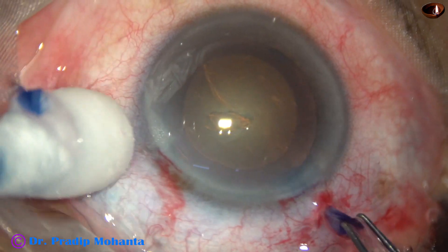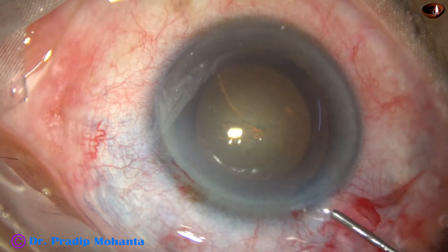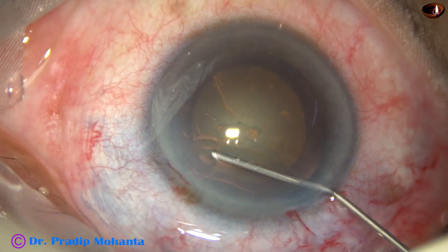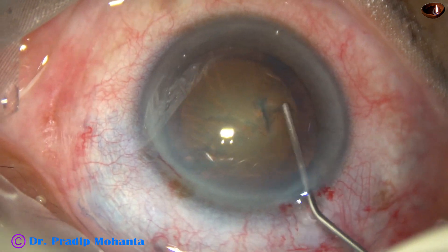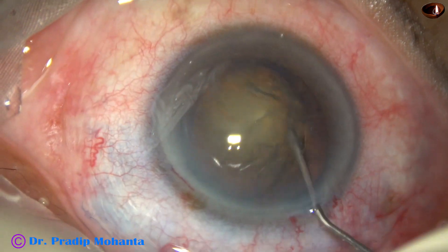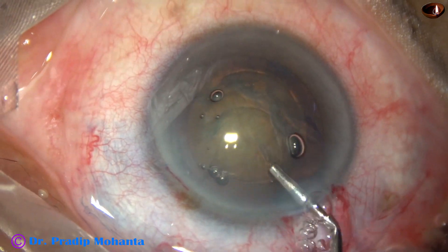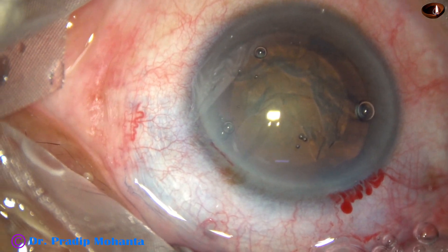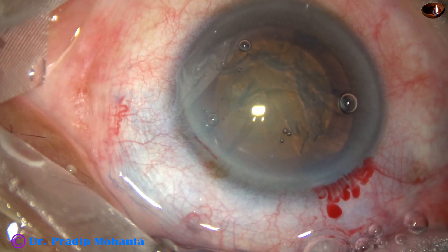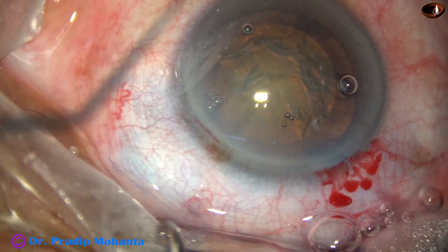This is a capsulorhexis of about 5 millimeters. Hydrodissection is done. The fluid wave is seen going towards the opposite side and the nucleus is tapped and rotated nicely. Viscoelastic is used to fill up the anterior chamber again. Now we are going to divide the nucleus by Stop and Chop technique.